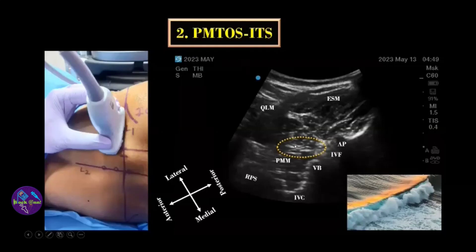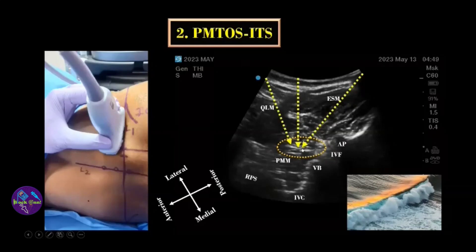Once you identify the lumbar plexus element, insert the needle either out-of-plane or in-plane, stimulate, and deposit the drug.